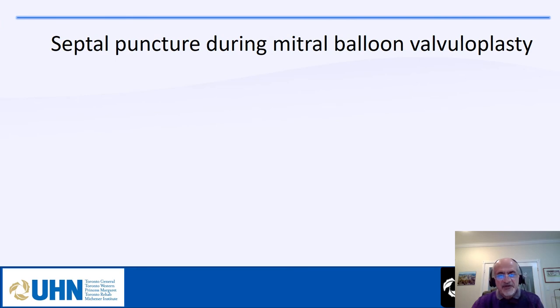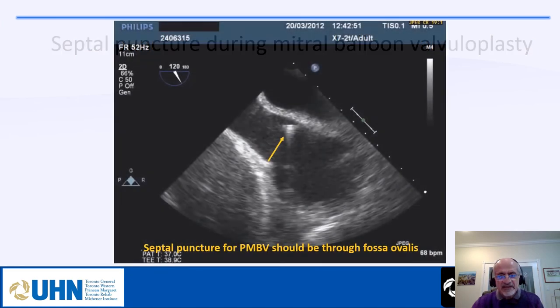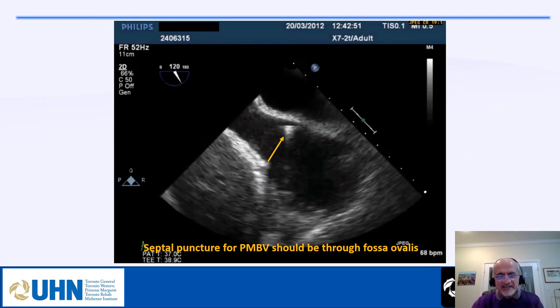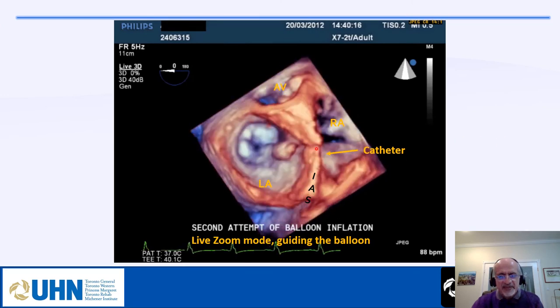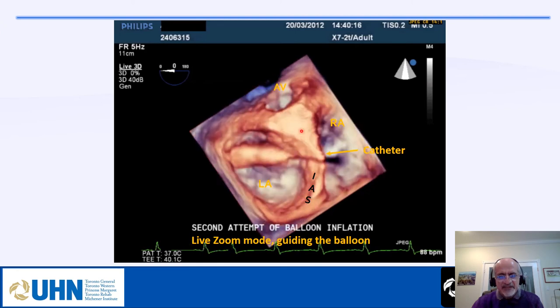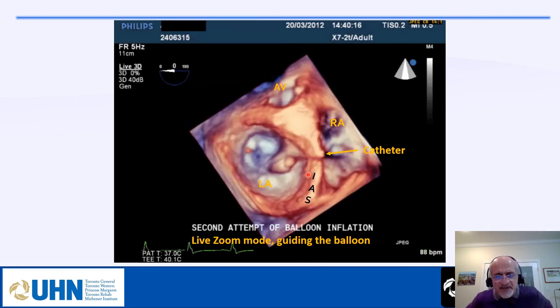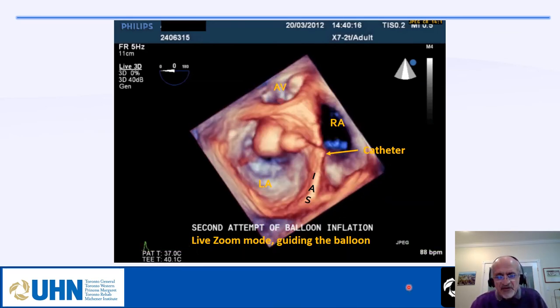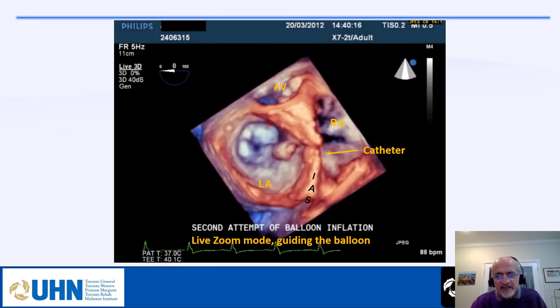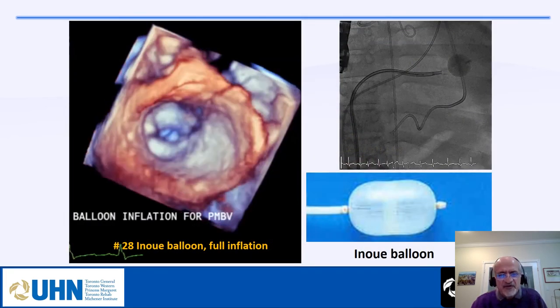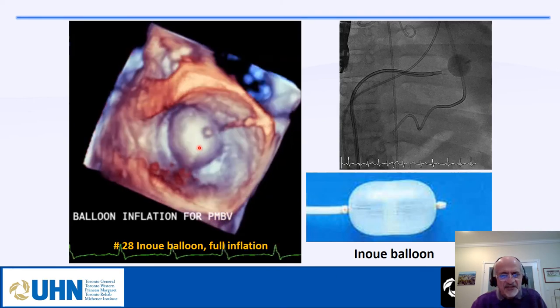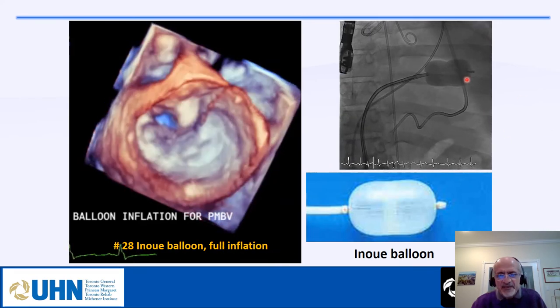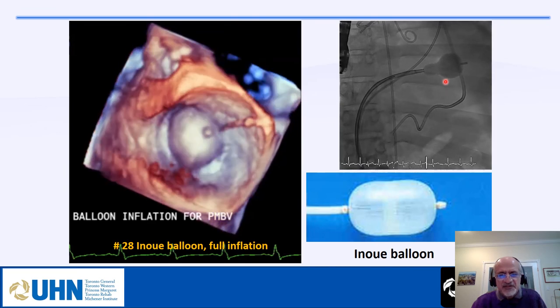For septal puncture during mitral balloon valvuloplasty, the puncture should be done from the fossa ovalis. We can see the balloon coming from the right atrium to the left atrium, and we sometimes perform mitral balloon valvuloplasty under live 3D guidance, though many expert interventionalists use fluoroscopy. This shows a very nice balloon inflation using the Inoue balloon, widely used especially in the Middle East for rheumatic mitral stenosis.